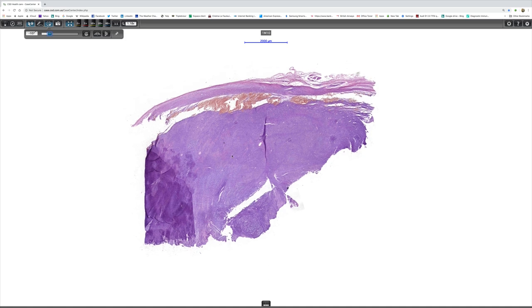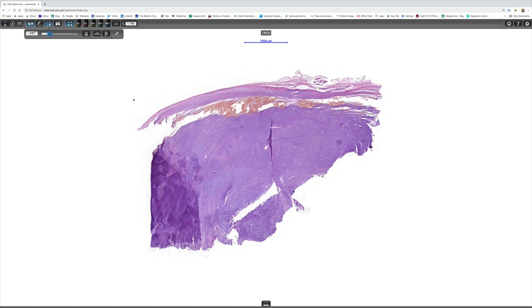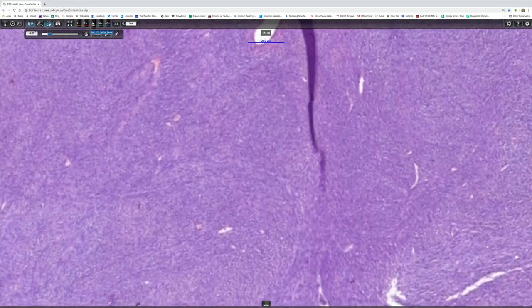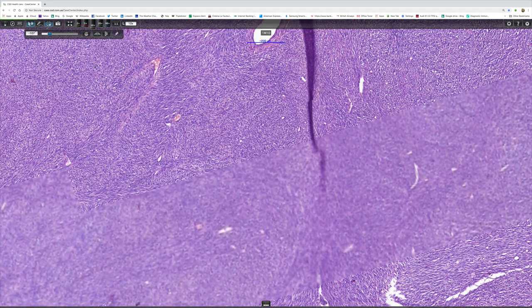Having said all that, let's have a look at this tumor. We can see very clearly there's a great big lump of blue tumor, and on top of it we can see connective tissue stretched around it forming a pseudocapsule. We'll look at this at higher power.